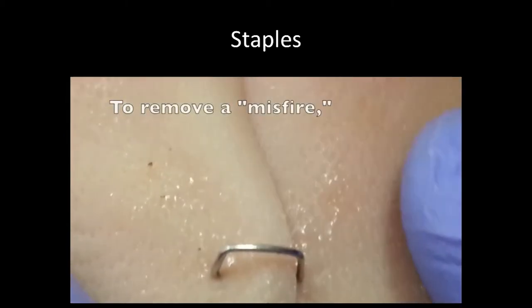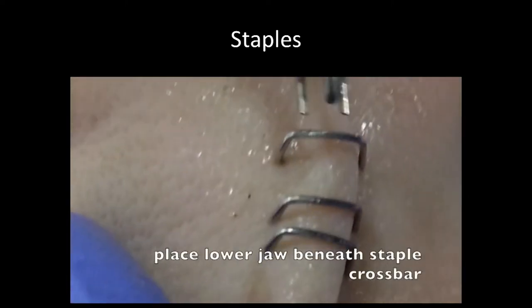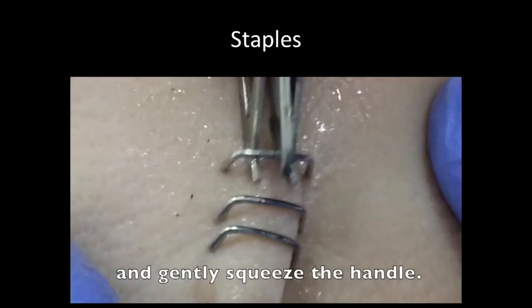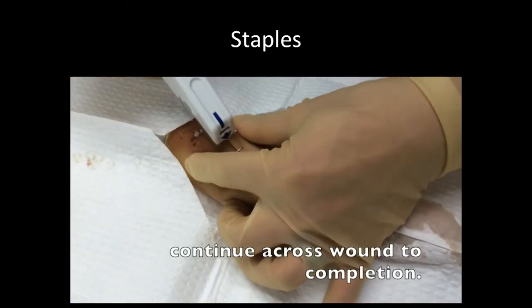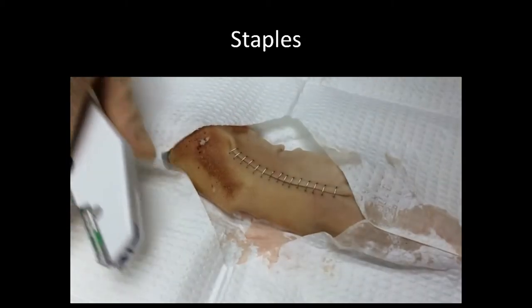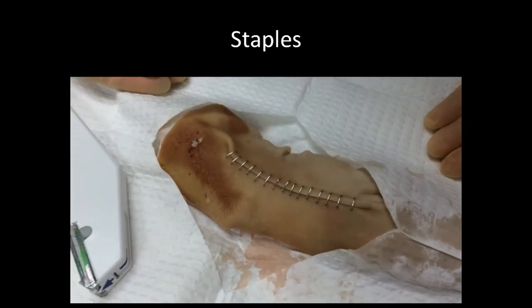Here's a tip. Always bring a staple remover with you when you're stapling, because in case you misfire, you want to have a device available to remove them. All you do is place that staple remover's lower jaw beneath the crossbar and squeeze the handle gently to remove those staples. You'll continue placing the staples across the wound until completion. And that's a nice way to easily close a long laceration.